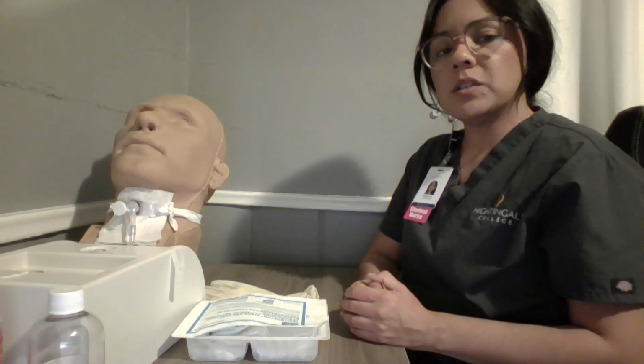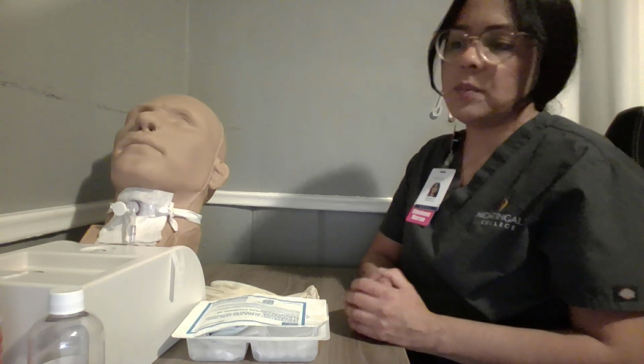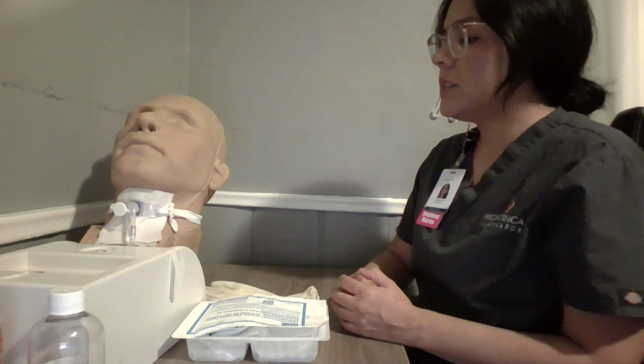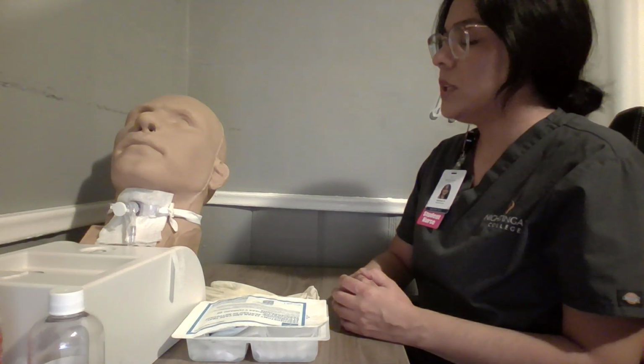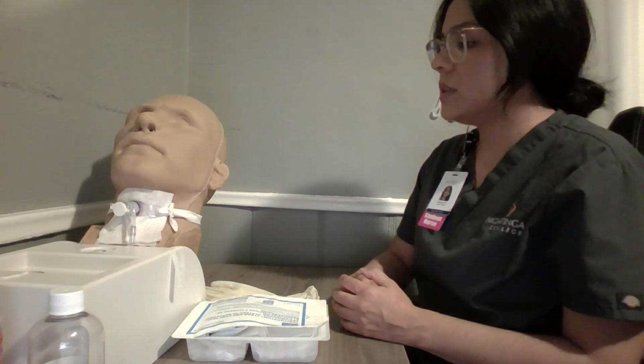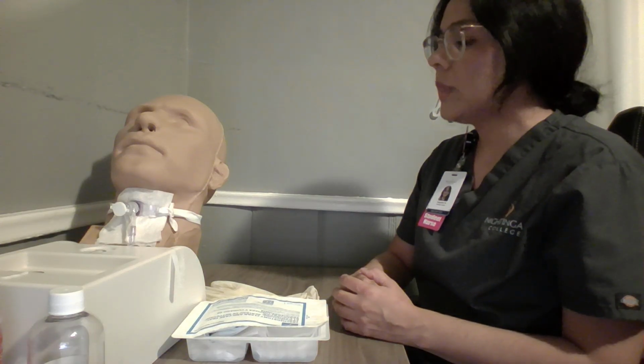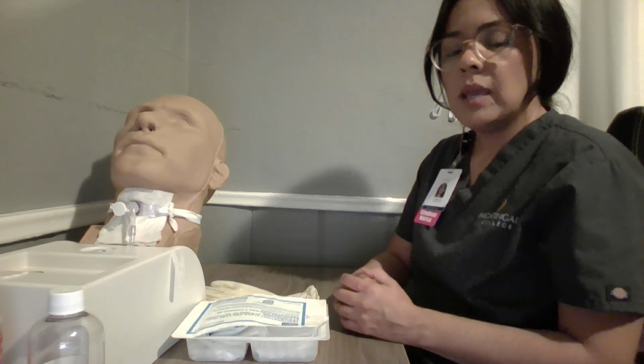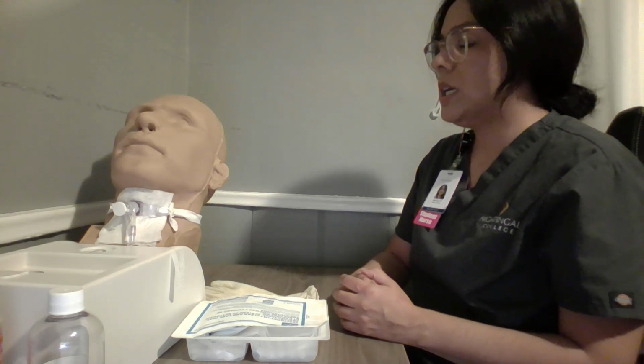I will enter my patient's room and close the door behind me to ensure patient privacy. I will perform hand hygiene. Hello, Mr. Johnson. My name is Stephanie, and I will be your nurse today. Can you please verify your first name, last name, and date of birth for me? All right, so I went ahead and verified using two patient identifiers. Today, we will be performing tracheostomy care on you.